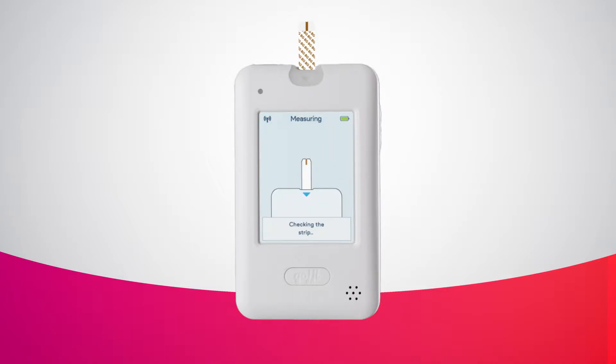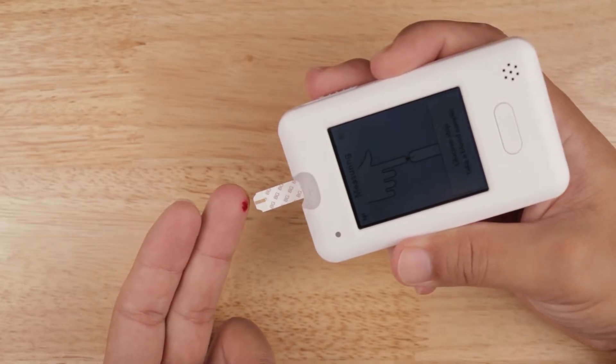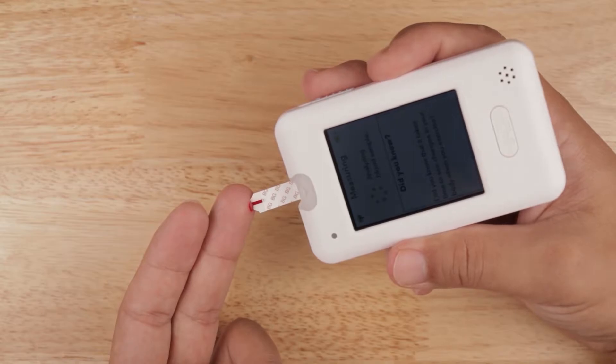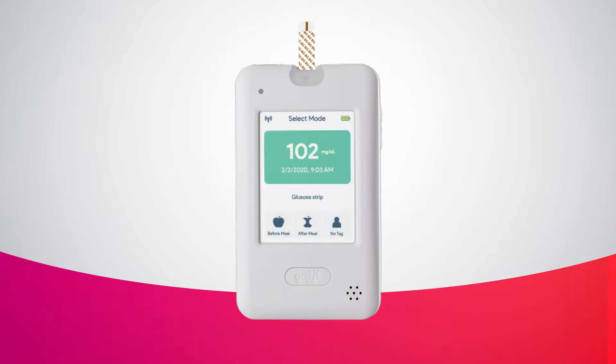The meter will do several self checks and will prompt you to take a blood sample when ready. Use your lancing device and lancets to get your blood sample. For more information about how to set up and use the lancing device, please watch our Using Your Lancing Device video. Hold the meter upside down and touch the blood sample with the tip of the test strip until the channel is filled completely with blood and you hear a beep. The meter will then start counting down.